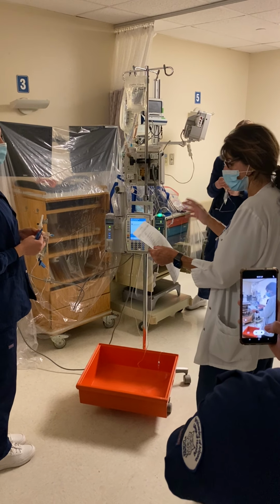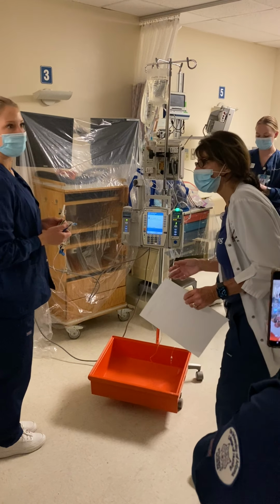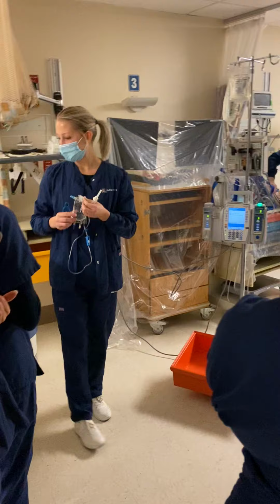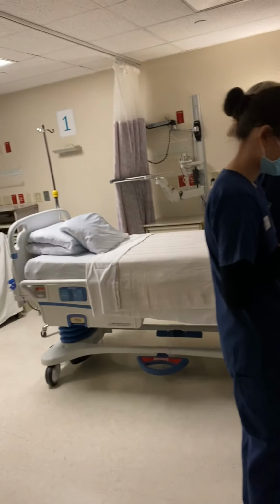So then you're gonna actually put on your gloves, but I don't think I brought any. I used to have a box in here over there. Okay. I wanna simulate it as, I don't know if I can read that. Yeah, I was trying not to make you put too many things in your bag.